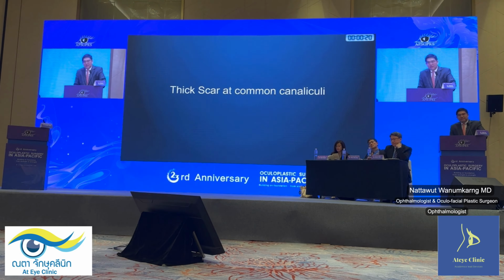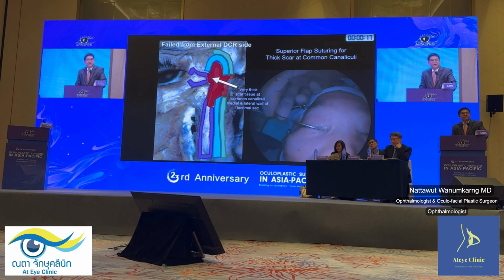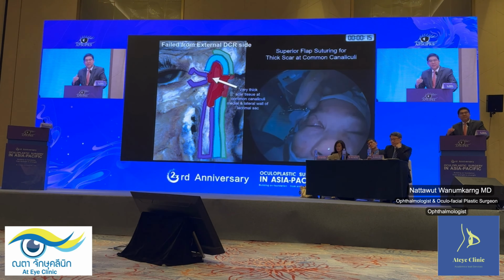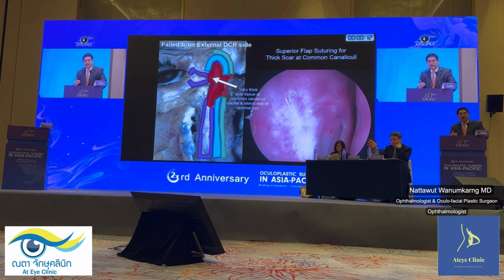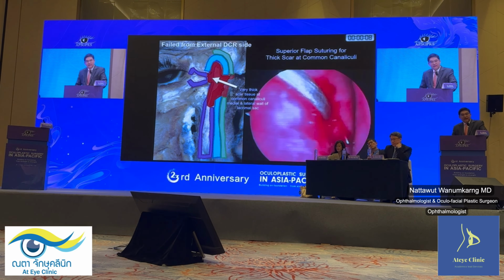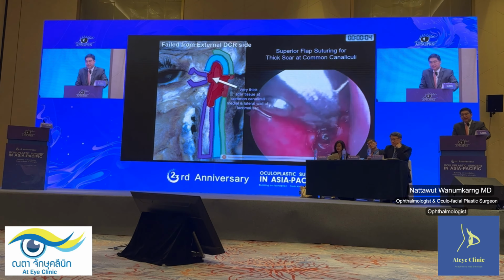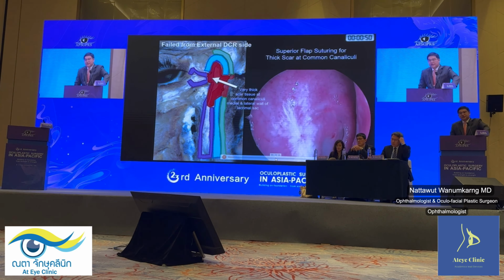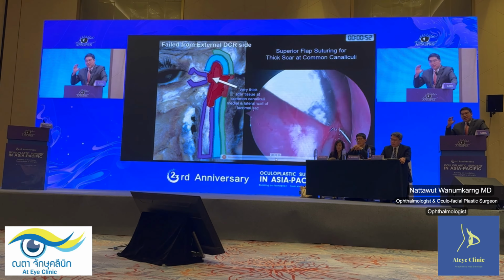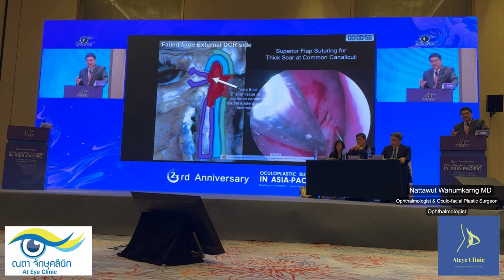And lastly, if you have a thick scar at the common canaliculi, this is more challenging. This is going to happen after multiple external DCR or multiple endoscopic DCR revisions. In my life, I have seen five or six revisions. This is a good video that shows a case that has very, very thick scar in the medial aspect of the lacrimal sac.